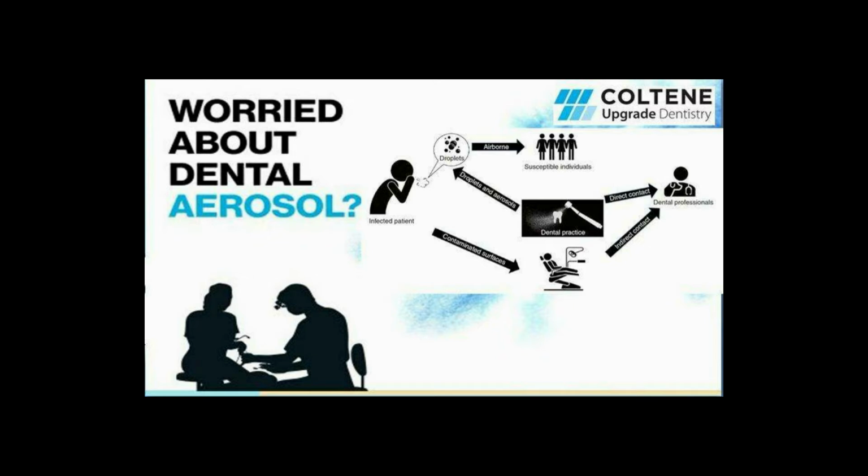If a patient enters our OPD and is coughing or sneezing, then this can result in contaminated surfaces. And by touching these surfaces barehanded, dentists can even catch infection. So we can infer that if we can control aerosol production at the site of production itself, then this vicious cycle of spread of infection can be checked, and rubber dam proves to be the biggest help in this.